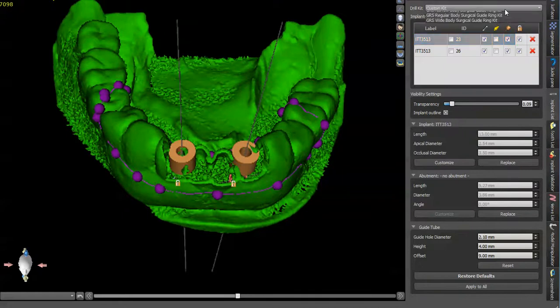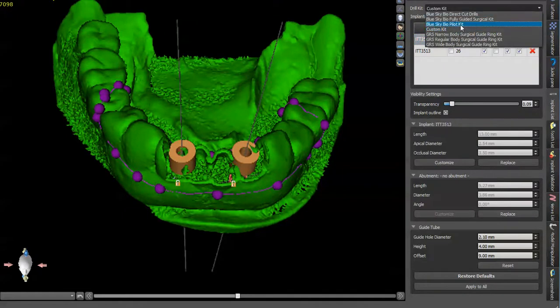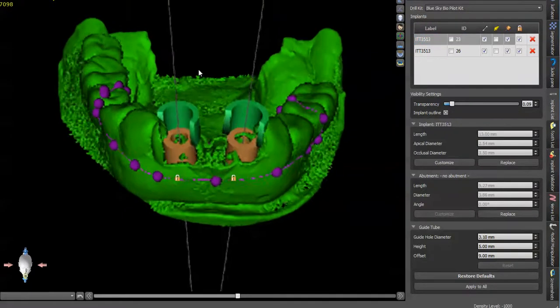And you have your guide sleeve tubes. If you change this to Blue Sky Bio pilot kit, it'll automatically default to a guide tube diameter of 3.1.